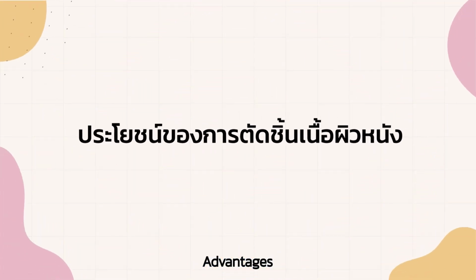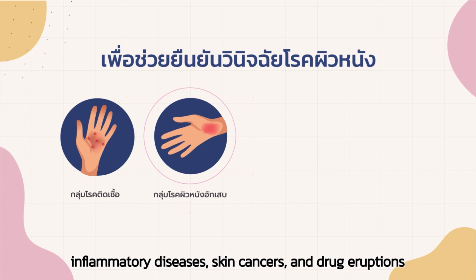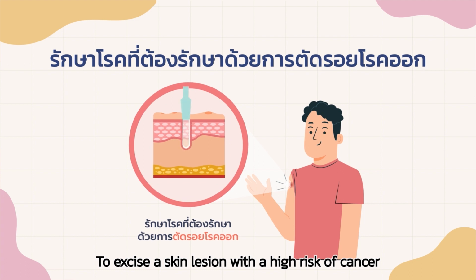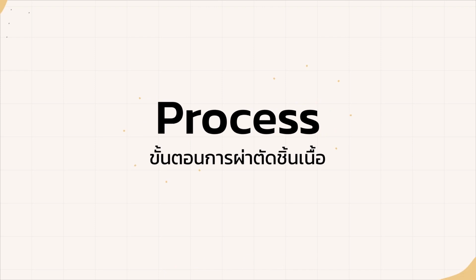Advantages. To confirm the clinical diagnosis in patients with skin infections, inflammatory diseases, skin cancers, and drug eruptions. To excise a skin lesion with a high risk of cancer. To predict prognosis in patients with certain skin diseases, for example, skin cancers.